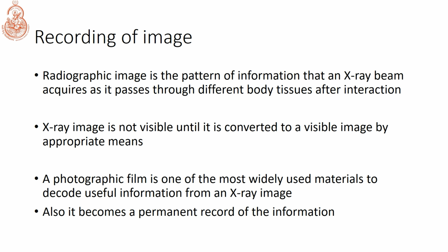Next is recording of the image. The radiographic image is the pattern of information that an X-ray beam acquires as it passes through different body tissues after interaction.